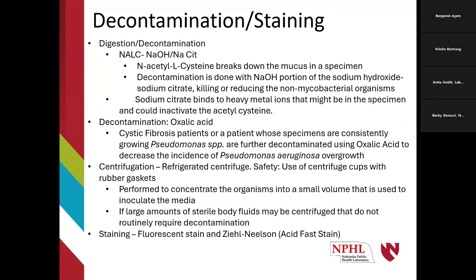We also have a sodium citrate. It functions in a couple of different ways. It helps to bind heavy metals, and it also helps in reducing specific gravity because of the lipid content. It helps bring down the organisms into a pellet easier.